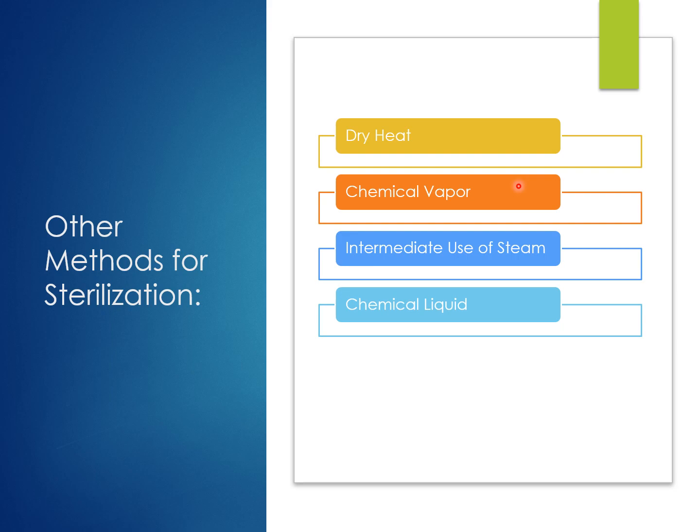This chemical vapor can't be used with all types of materials, and it can melt. So it's an antimicrobial, but sealed packages would prevent it from working. If you have heavily wrapped or sealed packages, the vapors cannot permeate that packaging. So we don't use or see that in dentistry very often. You might see that more in a hospital environment.